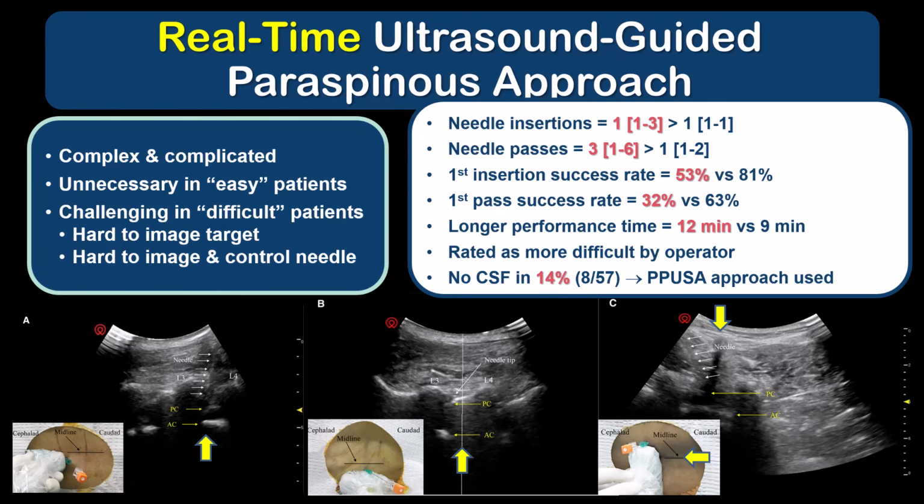I think all of us know how difficult it can be to visualize an in-plane needle, especially at large depths and with steep angles. In addition, as I've often said with obese patients, you have to use 2 hands to control the skin and advance the needle to make it go in a straight line, especially if it's a long needle. Though you could get someone else to hold the probe, but that isn't always feasible.